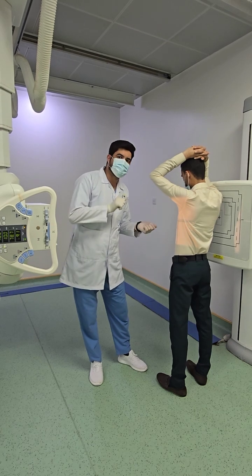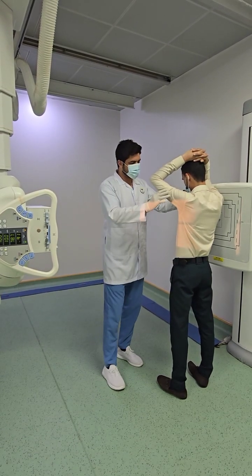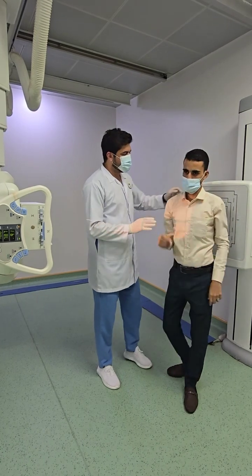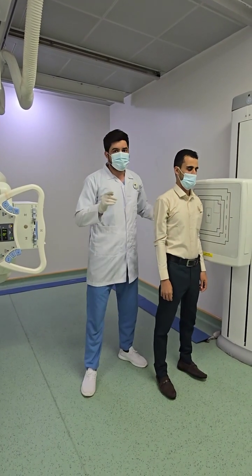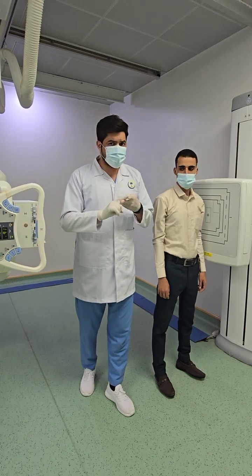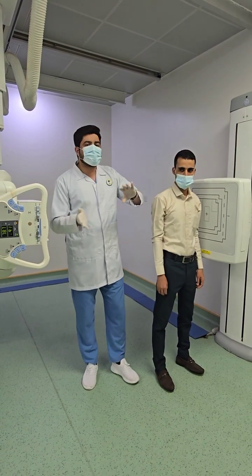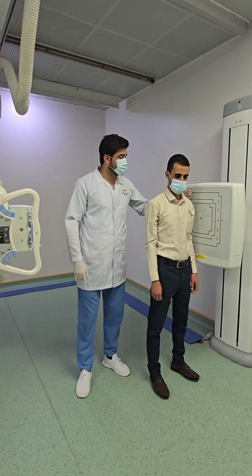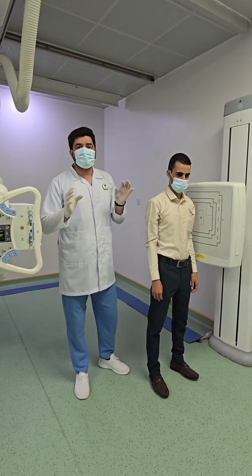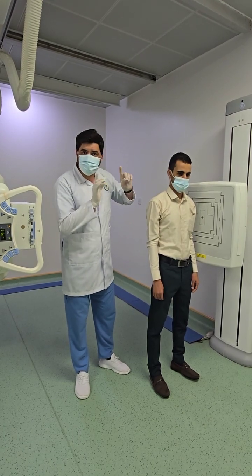How will we know which position the patient is in, right lateral or left lateral? Now look over here. This is the right side of the body, this is the left side of the body. I told you only in the PA and in the AP we will first consider the X-ray tube. And for all others like oblique and lateral you will consider first the detector. The side of the body which is near to the detector we will take first.